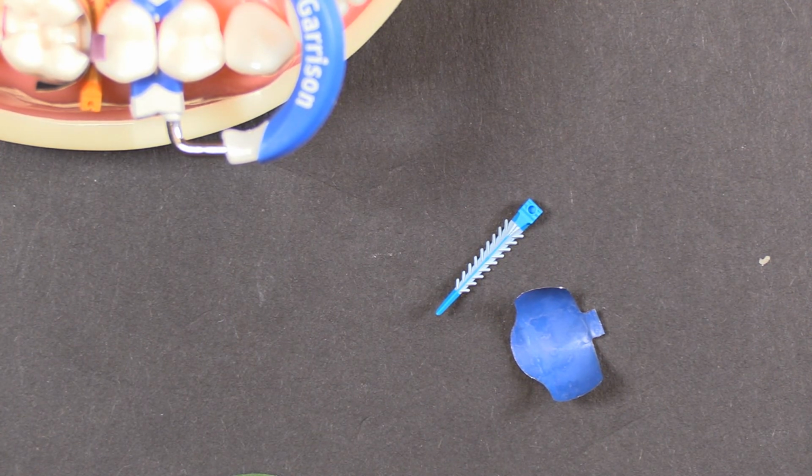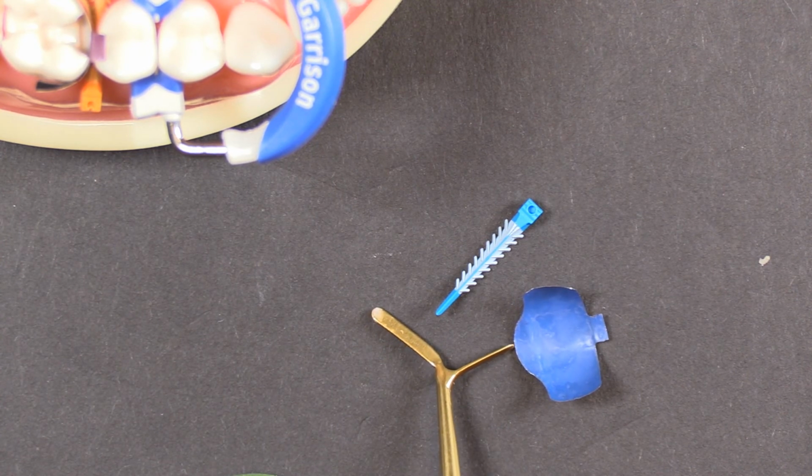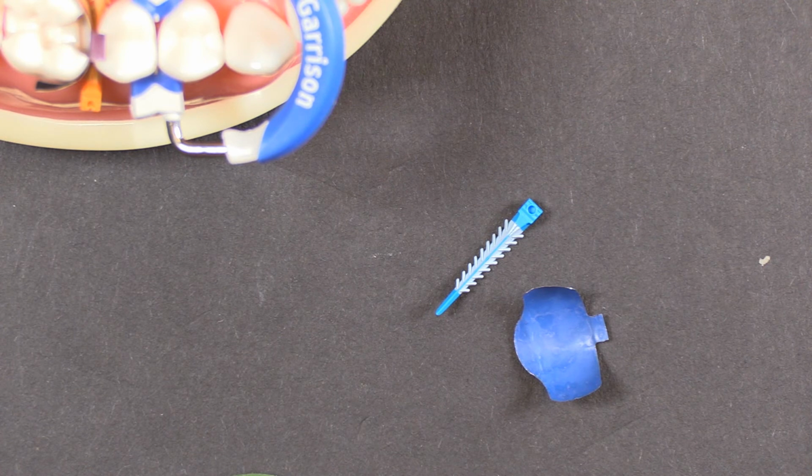His recommendation was, if you are looking at a case where this will extend just a millimeter and a half down subgingivally. If you're looking any deeper than that, his technique is pretty straightforward. He's going in there with a laser. He's taking that soft tissue back a little bit, and then he's restoring up to the CEJ with glass ionomer. It's a much more forgiving material for those types of tough cases. You don't have to worry as much about getting that seal, and then once you've got it built up to the CEJ, he places the sectional matrix system as you would normally and restores the tooth the rest of the way.